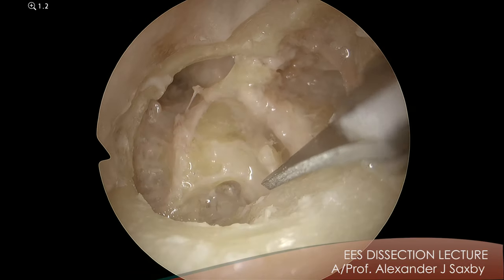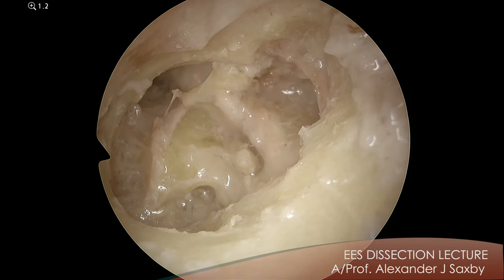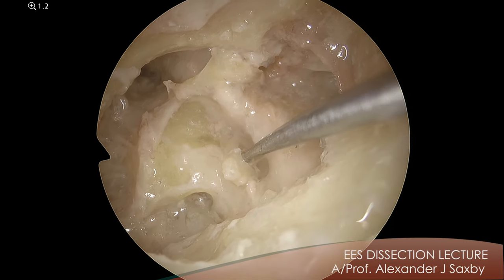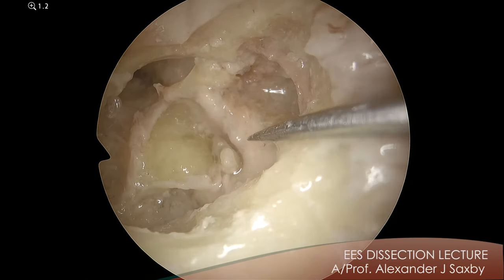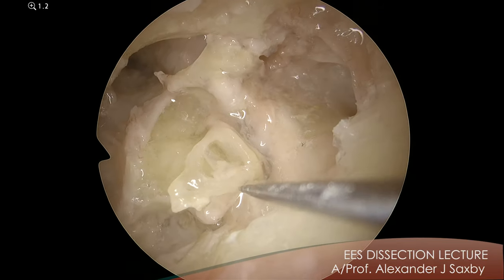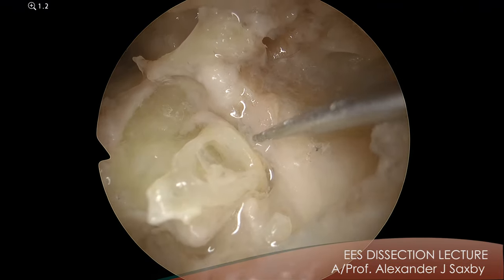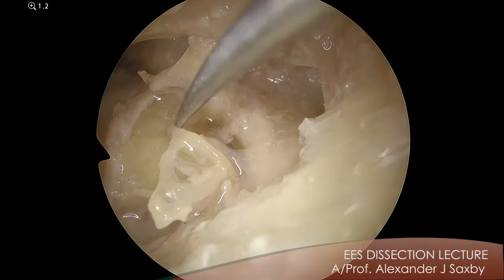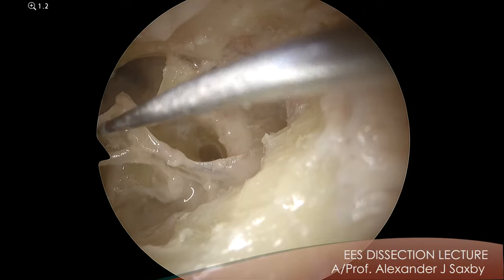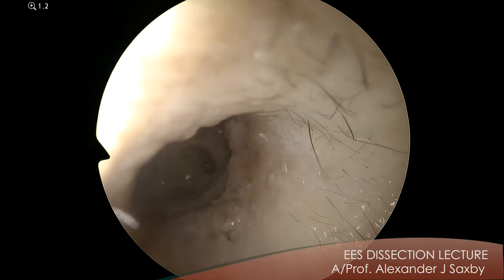So cut the tendon and then remove the stapes. Here comes the stapes coming out now. Everyone see the stapes? Can everyone see that the posterior crus is generally big, anterior crus is generally small. You can see the head of the stapes, you can see the footplate. And when we've removed it, you can see underneath it the membranous labyrinth. So let's take it out of the way. So now let's go and have a look inside the vestibule. I think for anyone doing stapes surgery, this is a very, very useful thing to do.